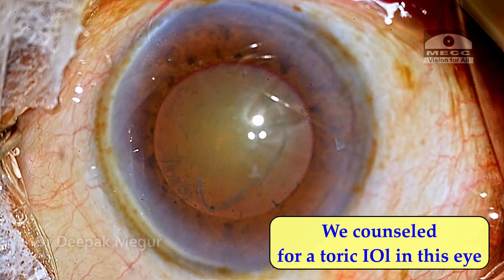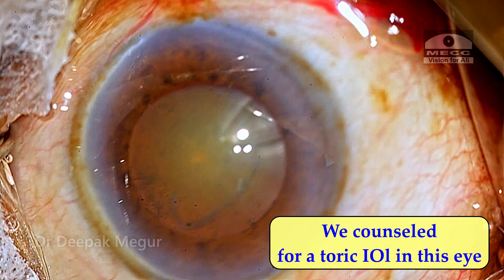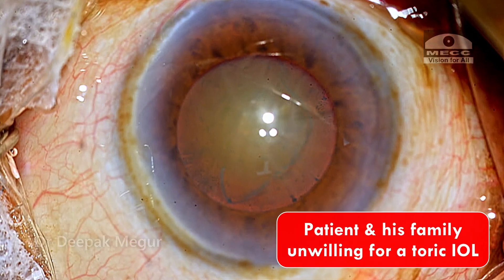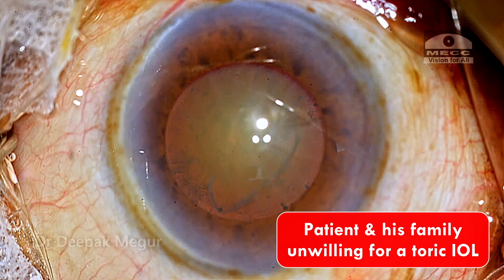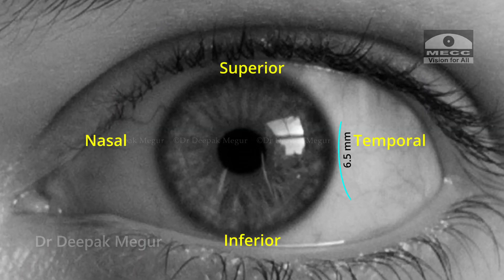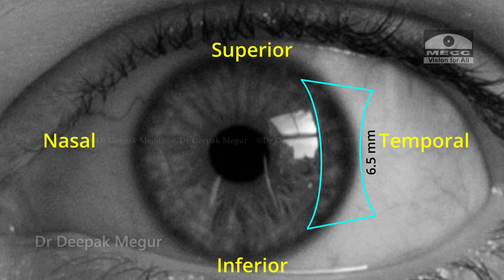We counseled the patient and his family for a toric intraocular lens in this eye to be operated, but he and his family were unwilling for a toric lens as they told us they can't afford it. To deal with the situation, I am planning a manual SICS surgery with a temporal incision of around 6.5 mm to counter this amount of pre-existing astigmatism.